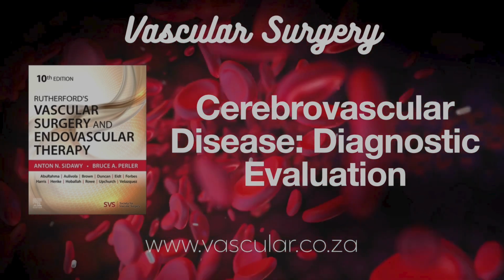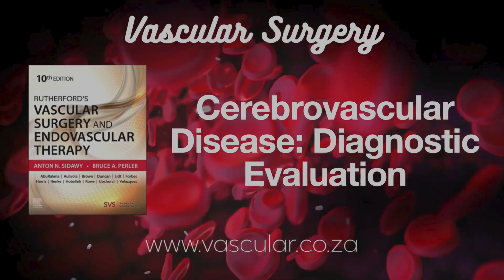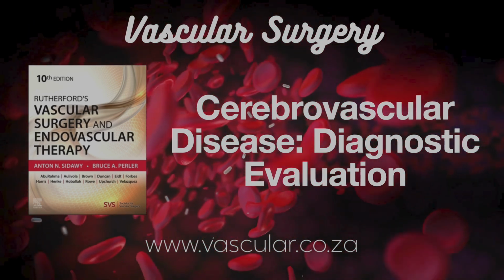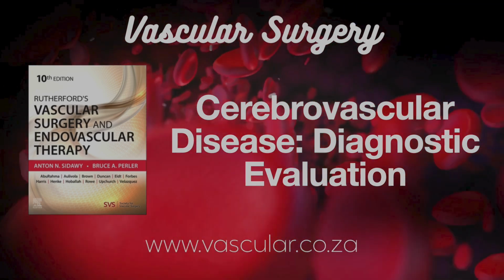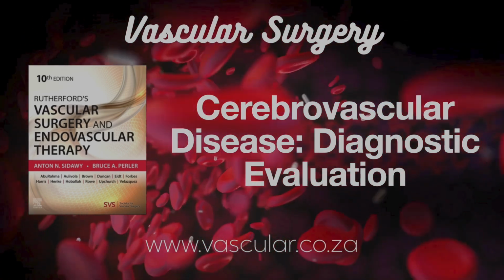Its role is more limited for the vertebrals. We can sometimes see if the flow is going the wrong way, retrograde instead of antegrade, which might mean a blockage further upstream. Yeah, like in the subclavian or innominate artery. But seeing where the vertebral arteries actually start, their origins, that's often difficult with DU.